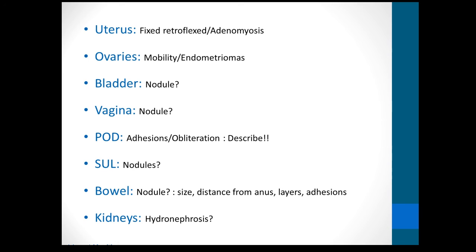And then looking at the bowel, is there a nodule, and describing the size, the distance from the anus, which layers are affected, and whether it's adherent to anything. And then looking at the kidneys for hydronephrosis.